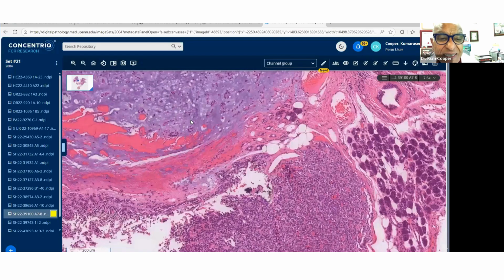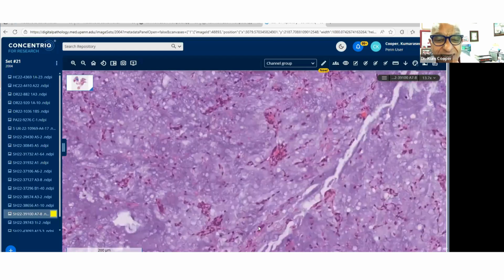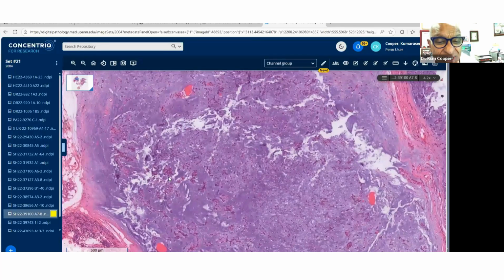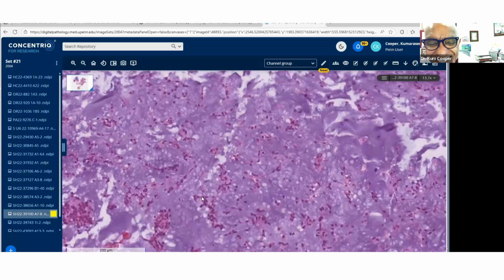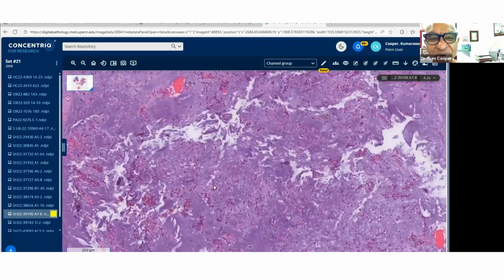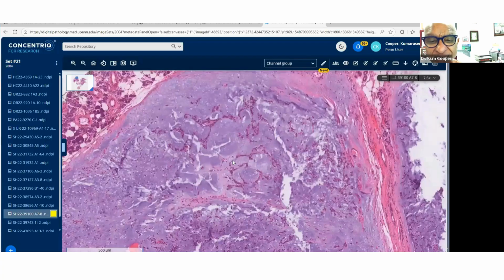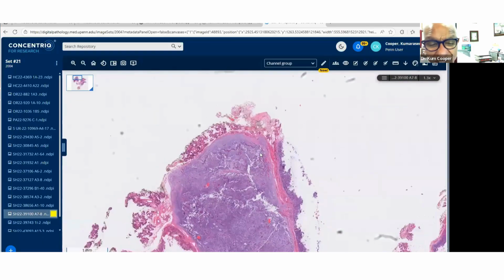But you will see here, there's this area, and I know you all know the answer here. It's myxoid, strands, cords. There's no epithelial structures here. Little nests of cells. Very similar to what we just saw, isn't it? Pink. Okay, and this is in the parotid gland. Here you go. Nice, beautiful little cords and nests here as well. All right, so there's that component.